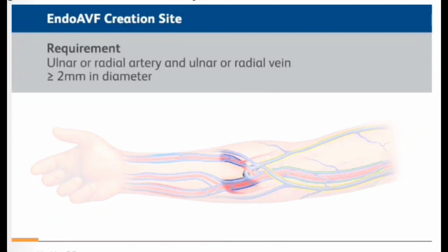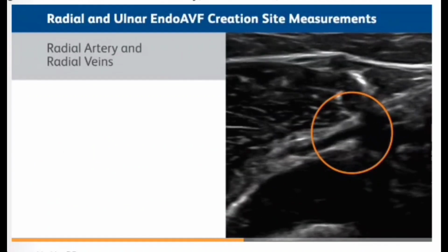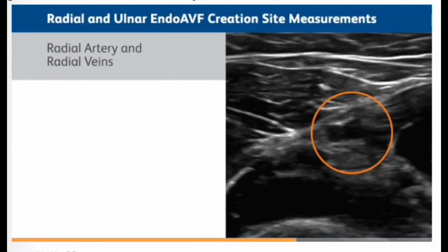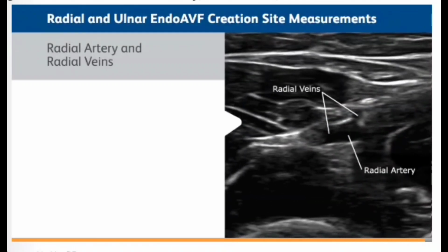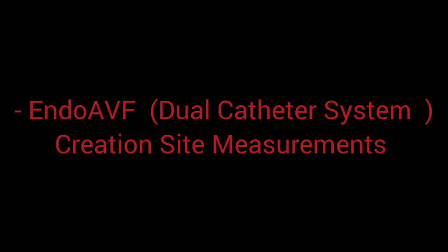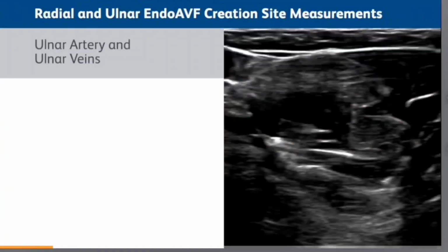The radial assessment should be taken immediately after the perforator and not too distal down the arm. Measure the radial artery and paired radial veins. Also, check for triphasic flow and calcium. After the radial takeoff, but before the interosseous takeoff.